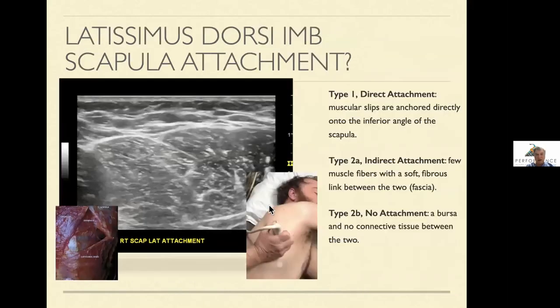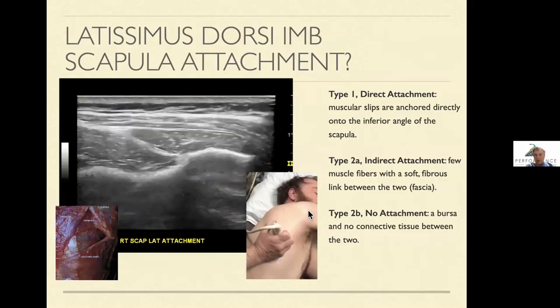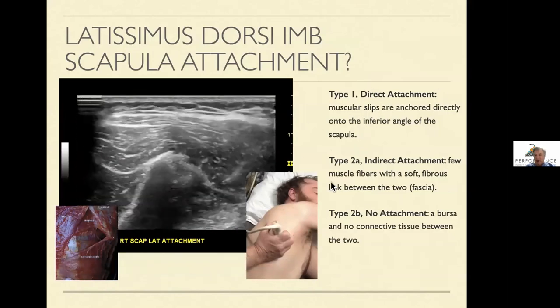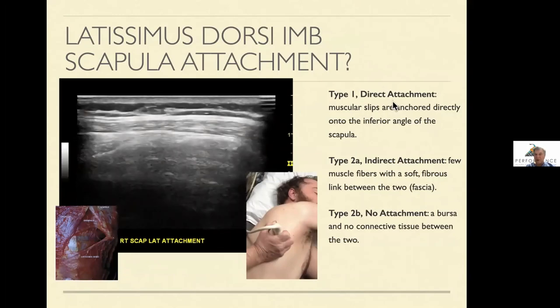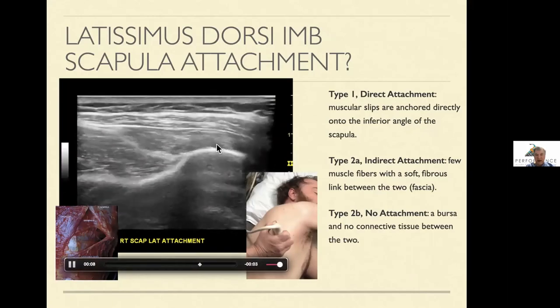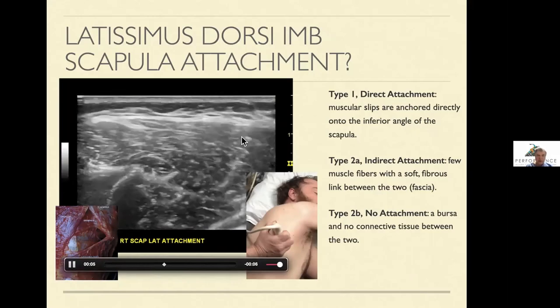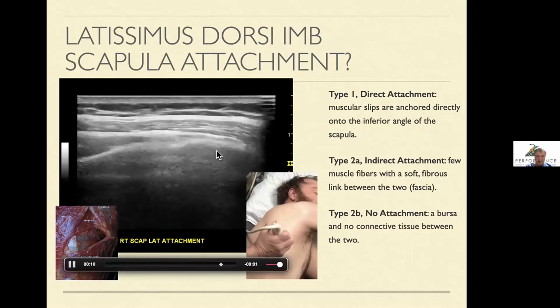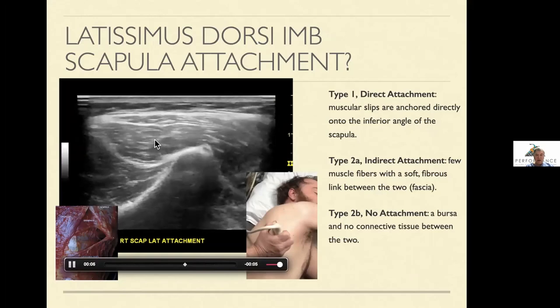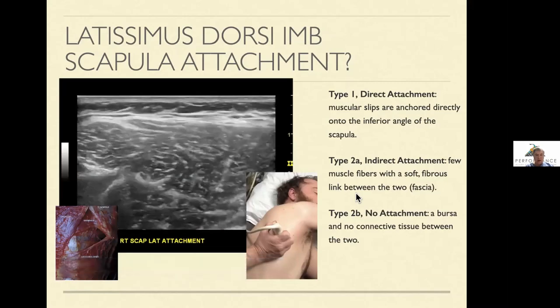Latissimus dorsi is the last thing in this basic protocol. In that same sidelying position, I pick up the latissimus dorsi and slide down to the inferior medial border. A high percentage of people — actually the greatest percentage — have some type of attachment to the inferior medial border, either a direct type 1 or indirect type 2. If you have this attachment, you are less likely to have shoulder instability. Frequently, you can see tears of the latissimus as it inserts into this area. Practice following latissimus fibers all the way down to the lumbar spine, as well as trapezial fibers to the thoracic spine.